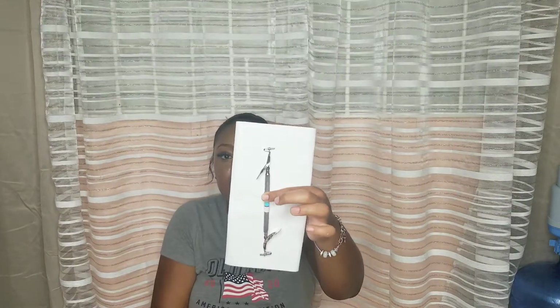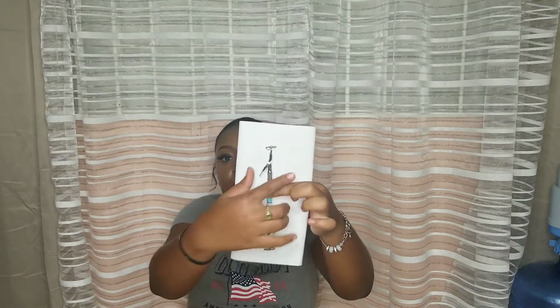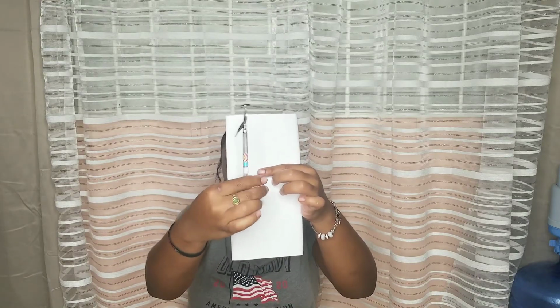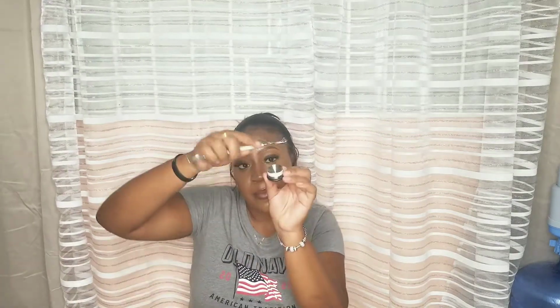After emptying the capsule in the well, you're going to need an amalgam carrier. So this is what a carrier looks like. It has these little things on it that you can press to remove the amalgam from inside of here. So you're going to use this to take the amalgam from in here, like scoop out some, put it in a cavity by pressing this, right? You guys probably won't understand, but you'll need an amalgam carrier.